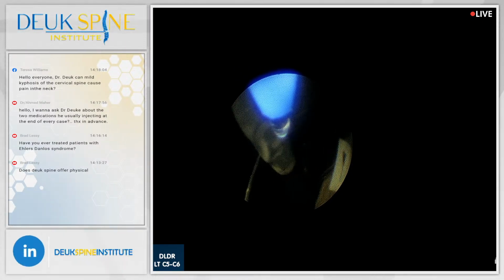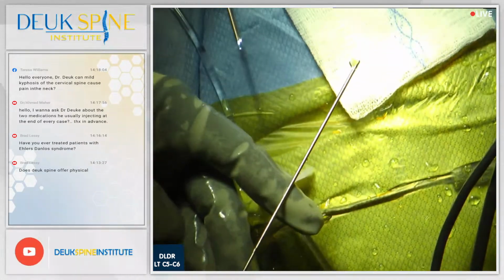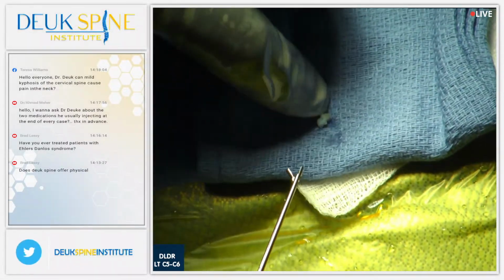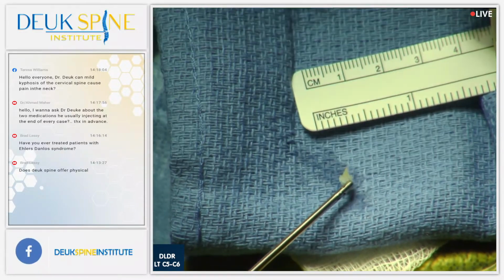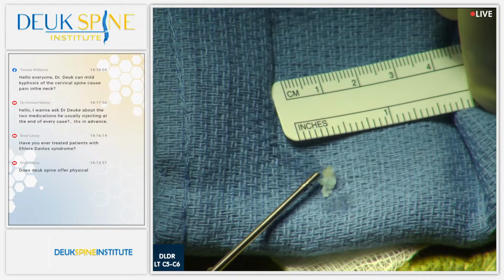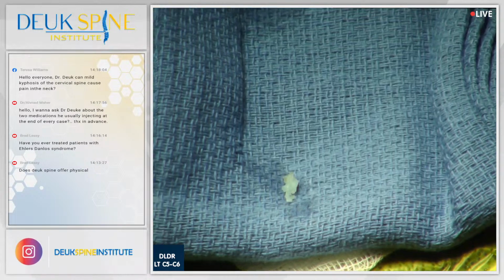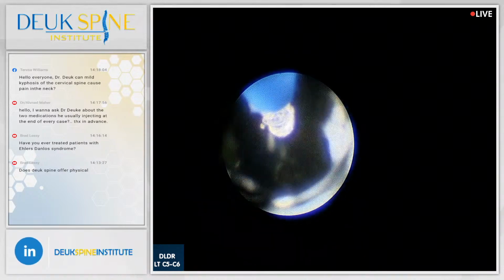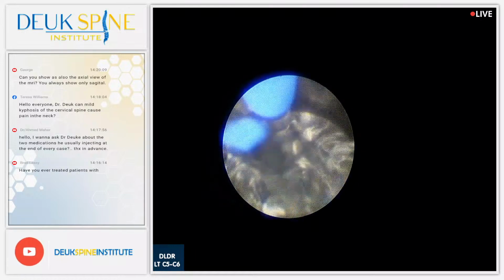Look at this piece of herniation I just popped out. Can you guys see this, Henry? Yes, we can. It's about 4 millimeters, but it's only one of several. I want you to look at it right here because it's quite interesting. You can see the blue dye which stains nucleus pulposus, nuclear material, and you can see the reddish brown stuff which is the scar tissue and inflammation. So you have a mixture of different types of tissue there. You have a reactive tissue, your body attacking it, causing inflammation and scarring, and then you have the actual disc hernia. Dr. B, I'm sorry, we have about 5 minutes max. 5 minutes. Looking good here. Yeah, 5 minutes.